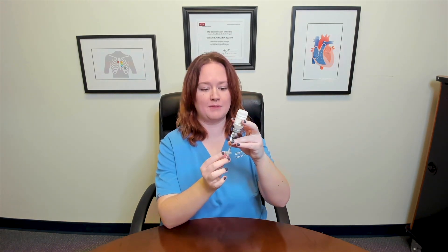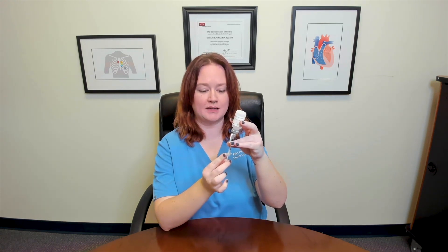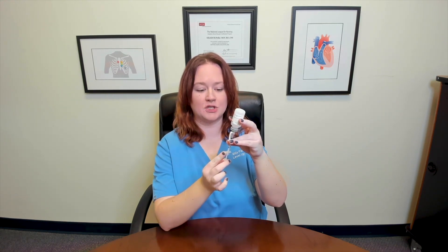Now I need my five units of cloudy insulin. So I'm going to insert my needle, invert my vial, and this time I'll pull my plunger back to the number 10, as I'm drawing an additional five units. And now I have clear and cloudy insulin in my syringe that I can administer to my patient.